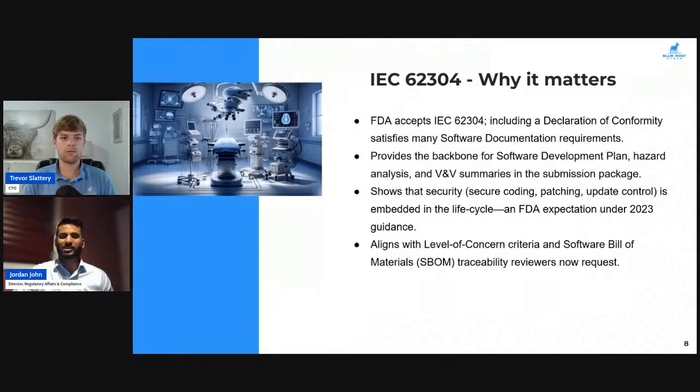But of course, it's the same kind of methodology as your general design controls, where you start at design, you assess for risks, you go into risk management, you mitigate it as far as possible. And in order to demonstrate that you have done that, you need to run V&V tests, verification and validation. So really, 62304 is a general standard that's been around for a long time, and it's going through revision as well. But really it ties back into how it impacts cybersecurity and how you in design build in security so that it's inherent by design.